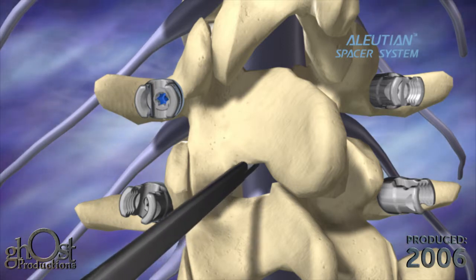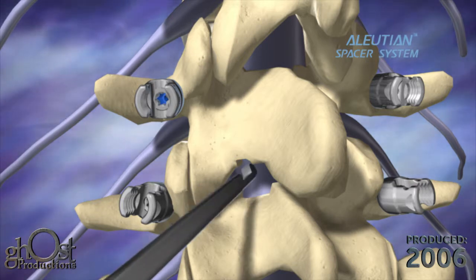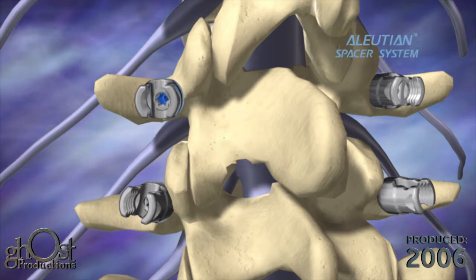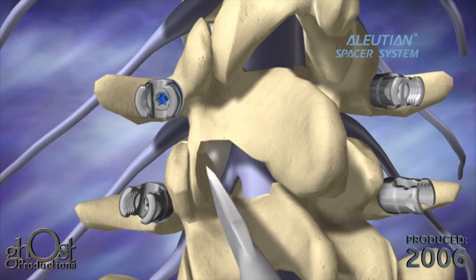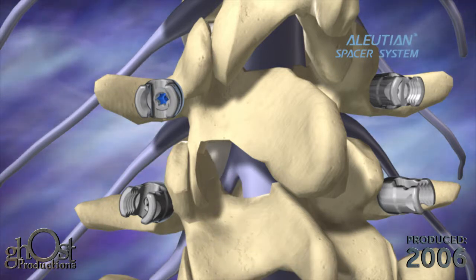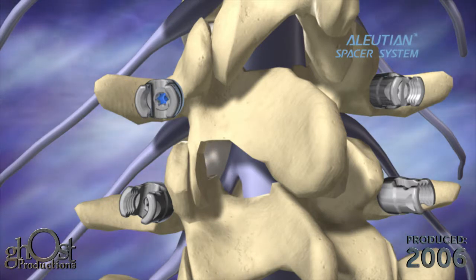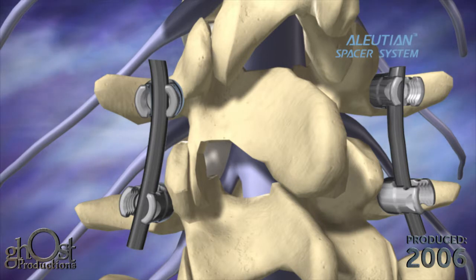Using a combination of surgical instruments appropriately selected by the surgeon, a laminotomy, laminectomy, and/or facetectomy is performed, along with the removal of the ligamentum flavum to gain access to the disc space and identify neural and bony anatomy. Once all screws have been inserted, the rod size is selected or cut to the appropriate length for the construct.